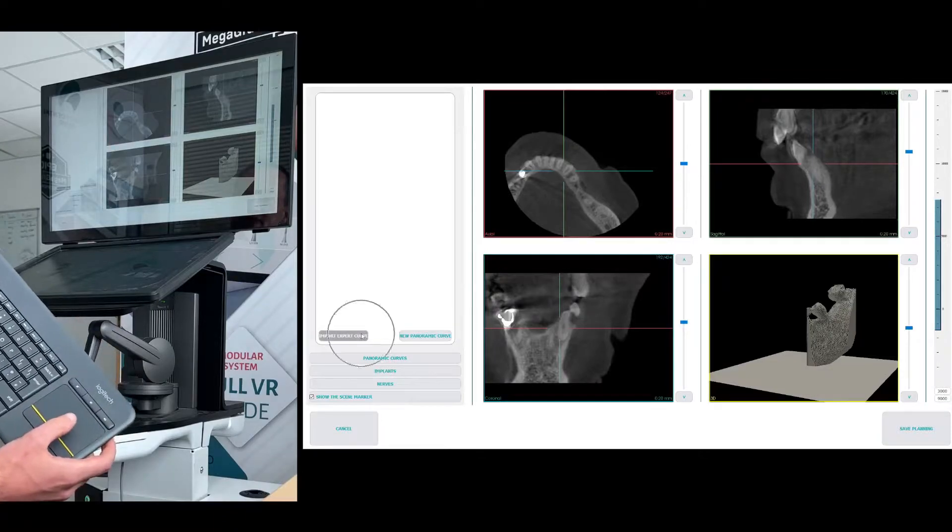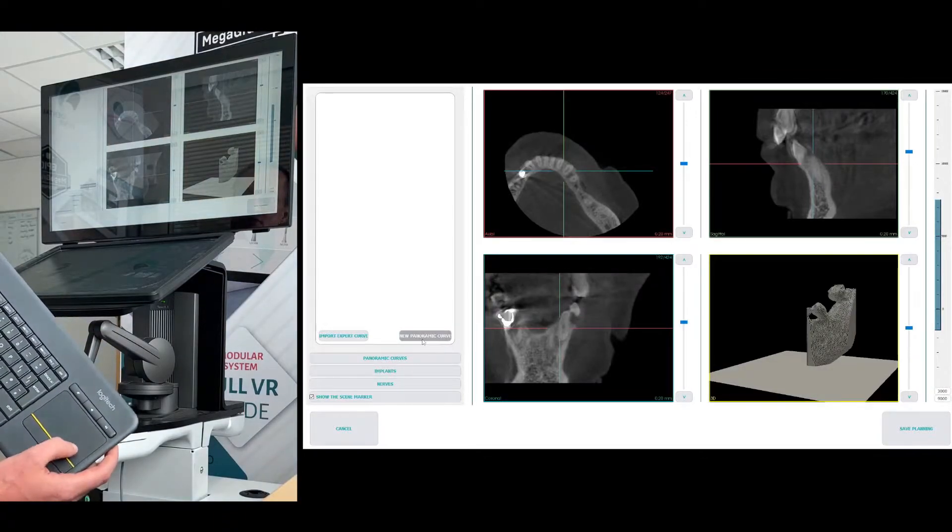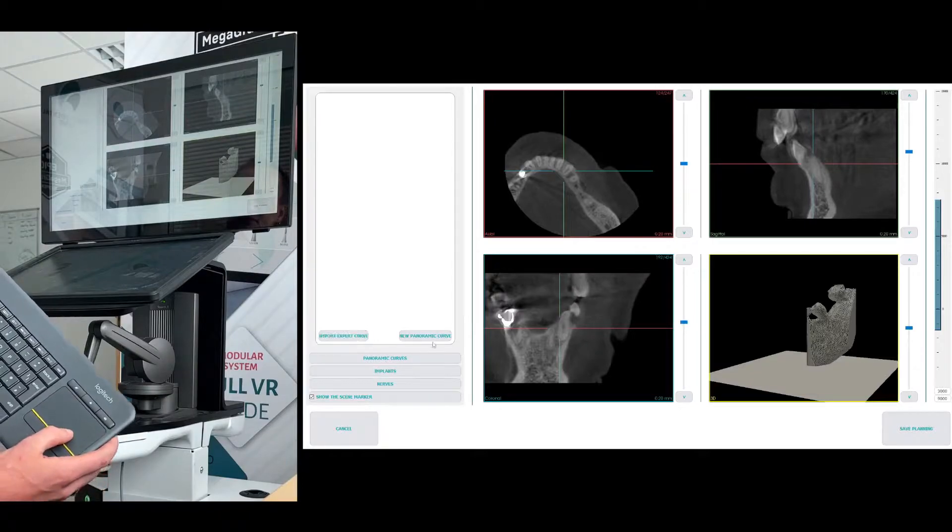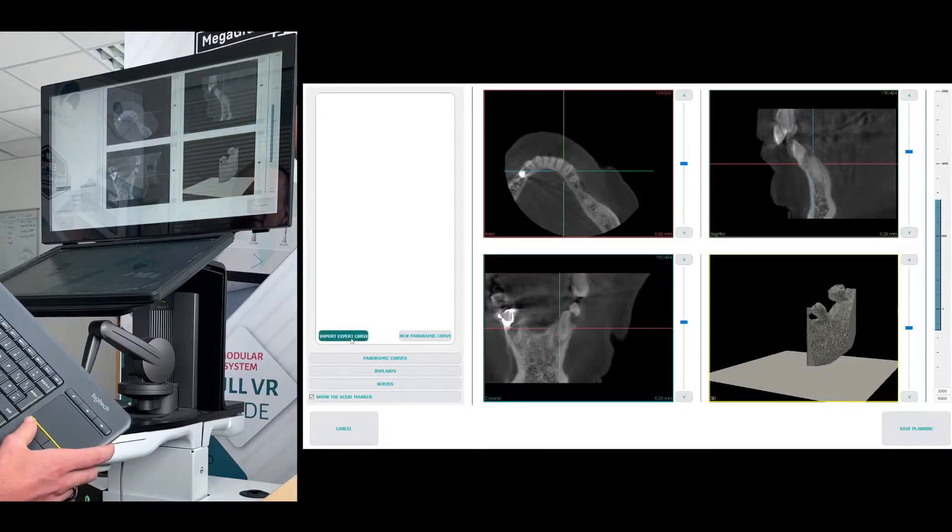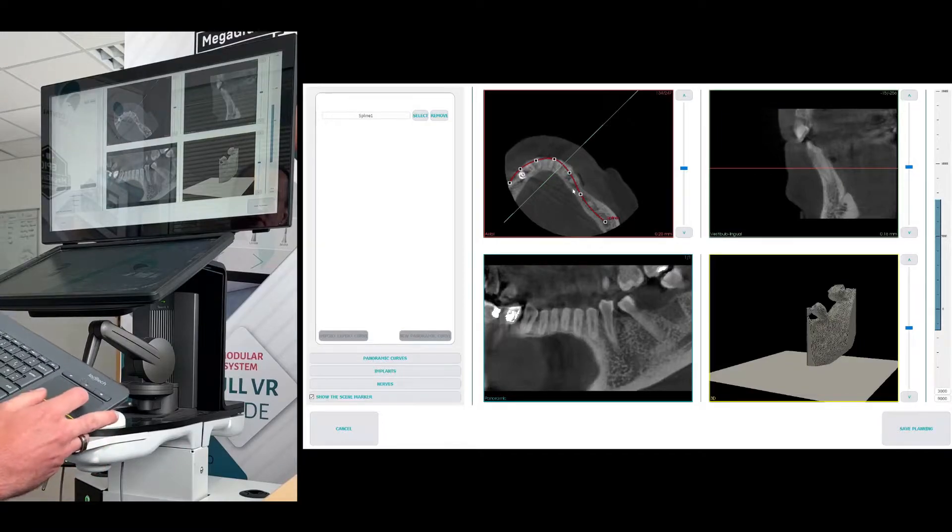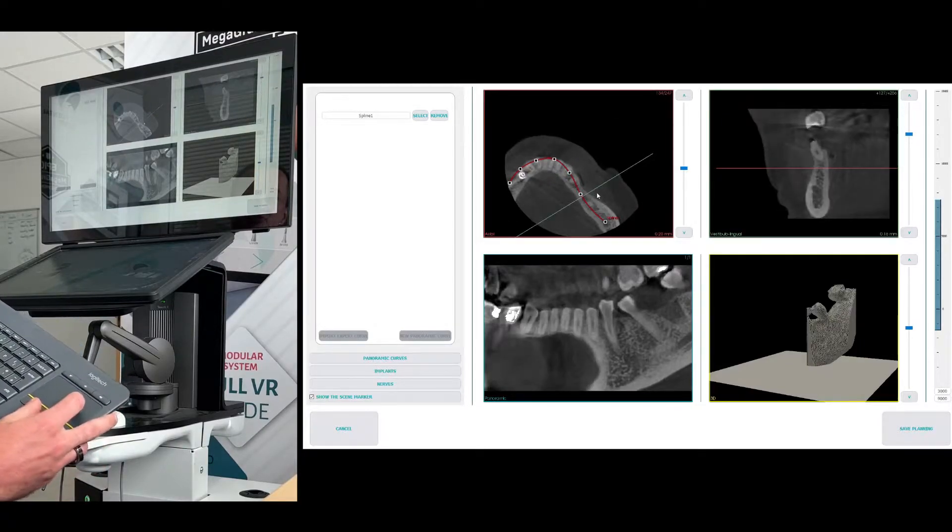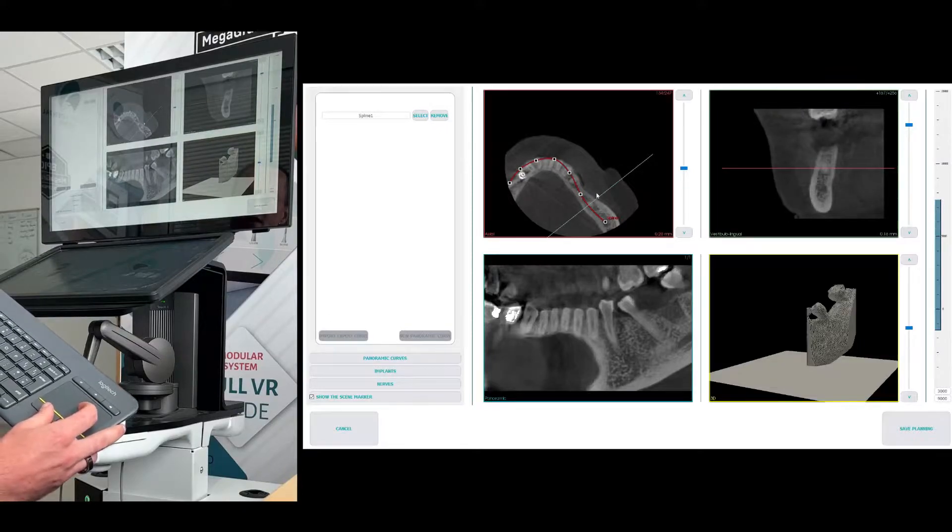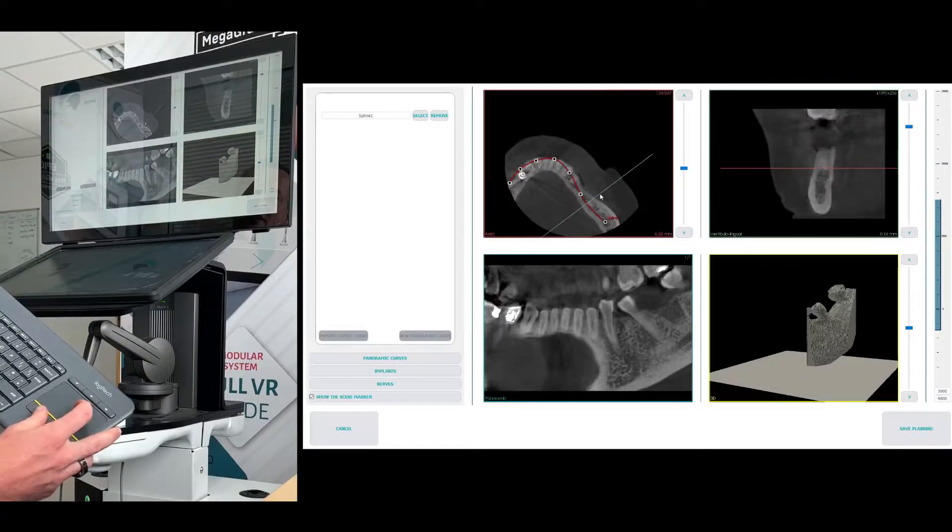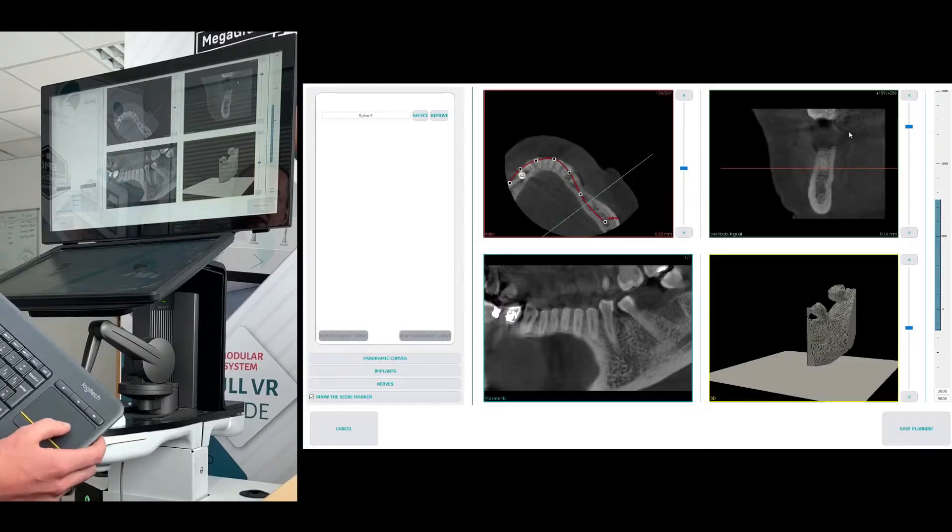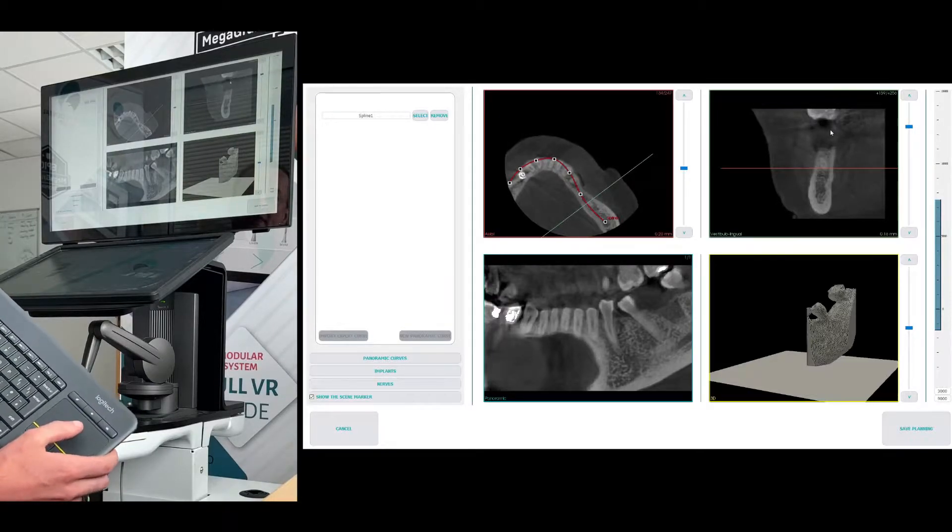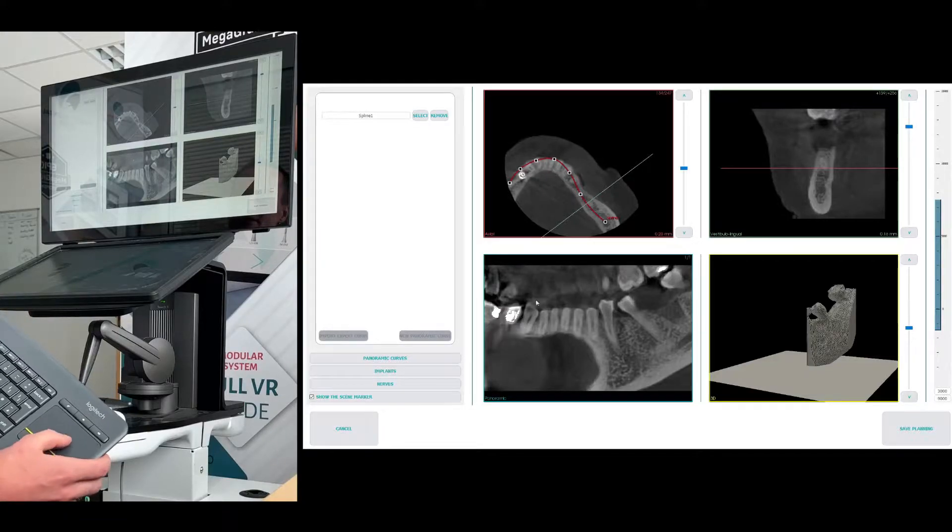So on the left, we have the panoramic curve. And here we have two options: import the expert or create a new. I recommend importing the expert curve because this allows you to then have a comparison between the two different plannings afterwards. By clicking the certain places on the axial view, you'll see it updates the lingual and there I can see this is where we need to place the implant.